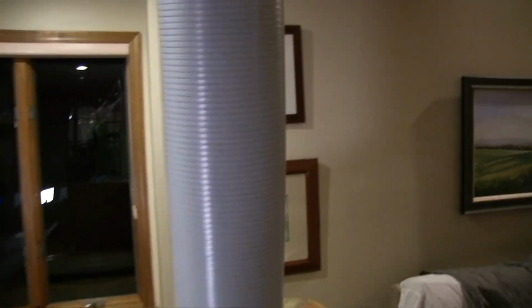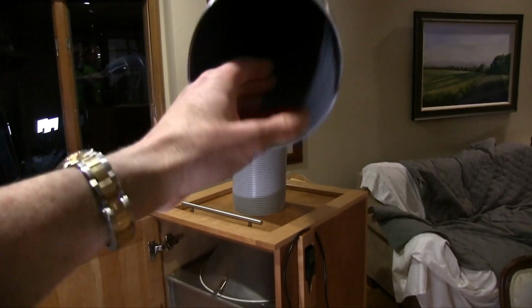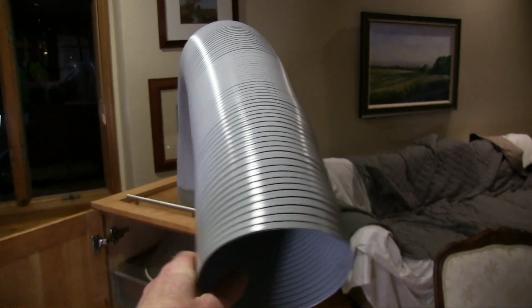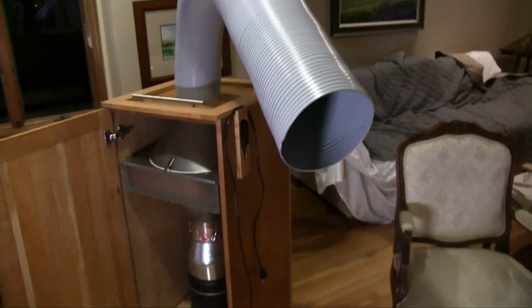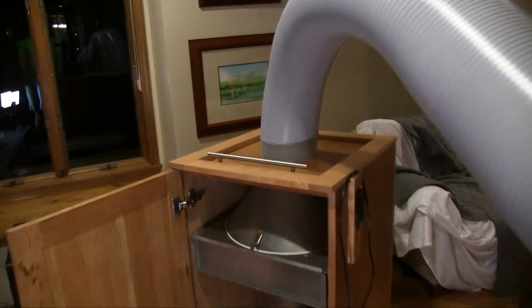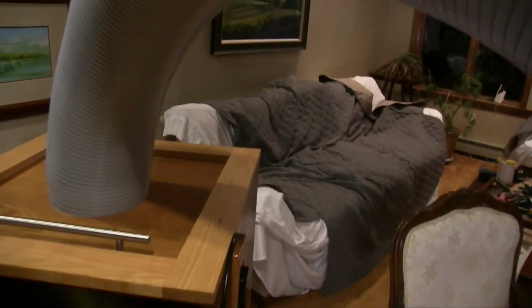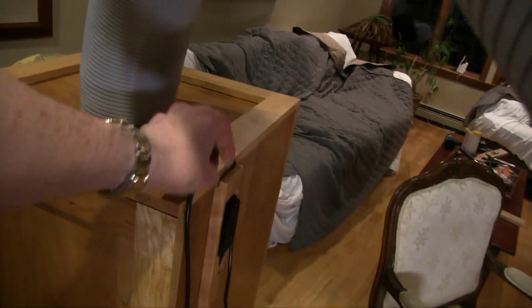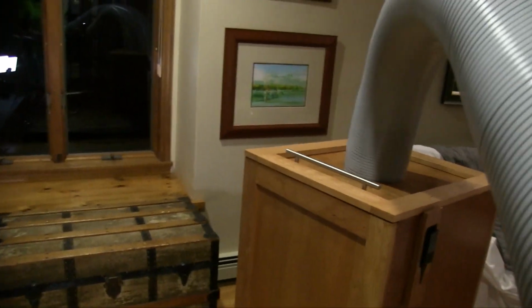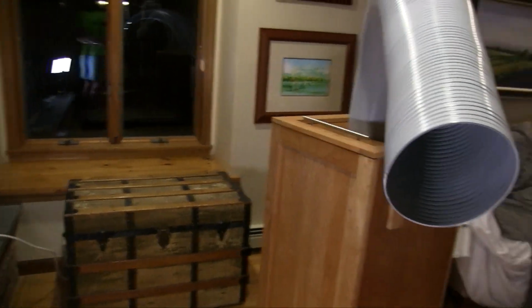So the idea, this is a 6-inch flexible PVC. It's self-supporting, so you can just leave it over the patient like this. What we would do, if we're doing something that generates aerosol, or a hygienist is doing a scaling with an ultrasonic scaler, you'd wheel it over, you'd plug it in. Let me plug it in and I'll show you how it works.